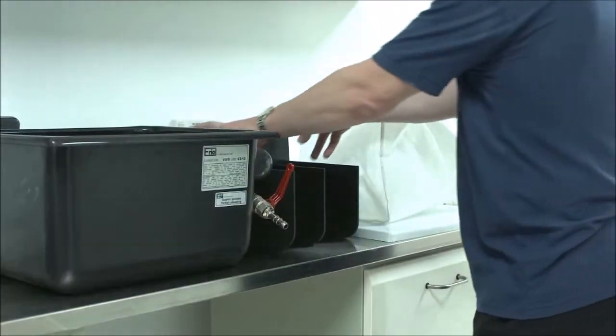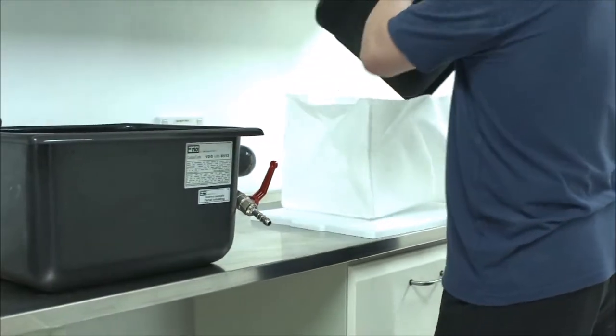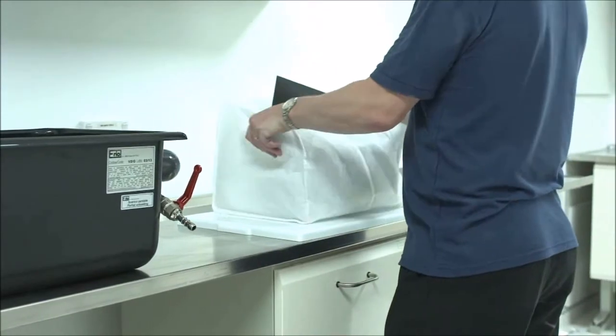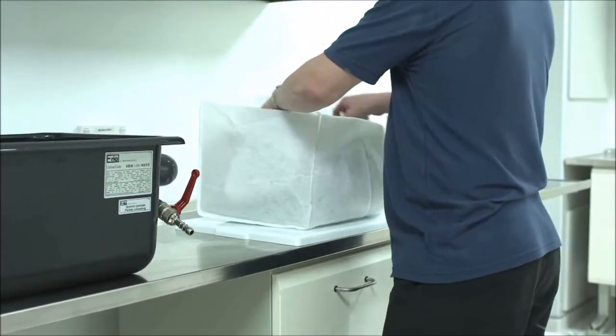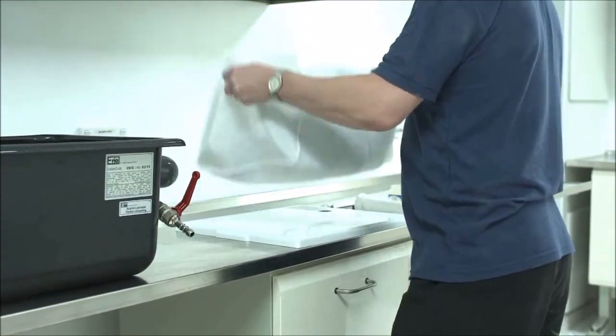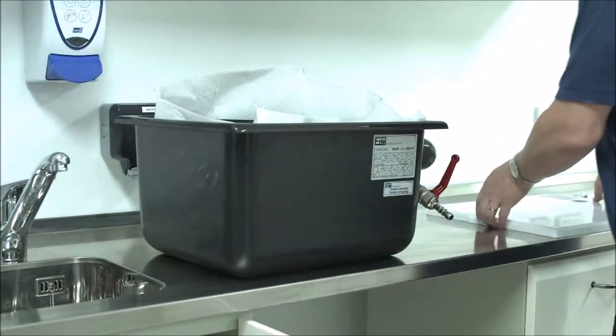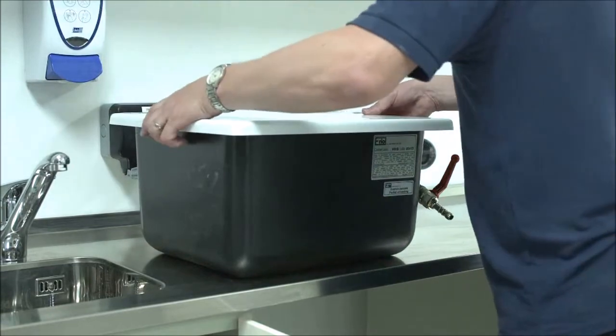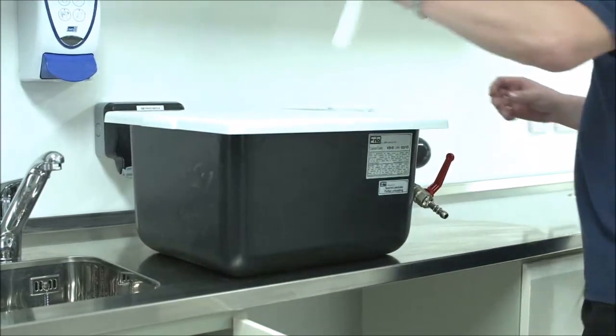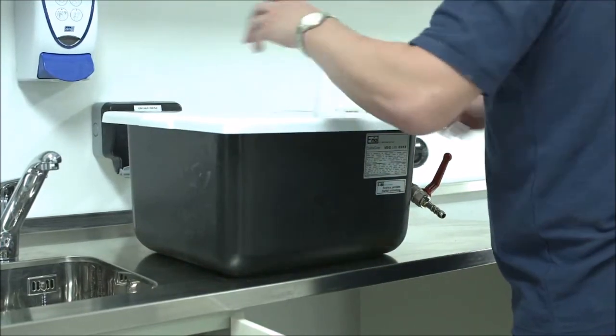Take a new bag, put the dividers in, place this back into the decantation unit. Put the lid on and the connection. Place back into the cabinet.